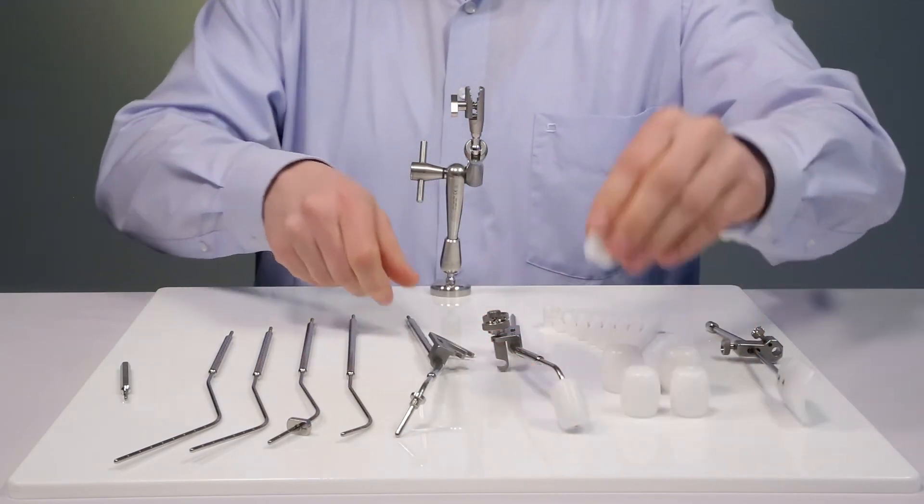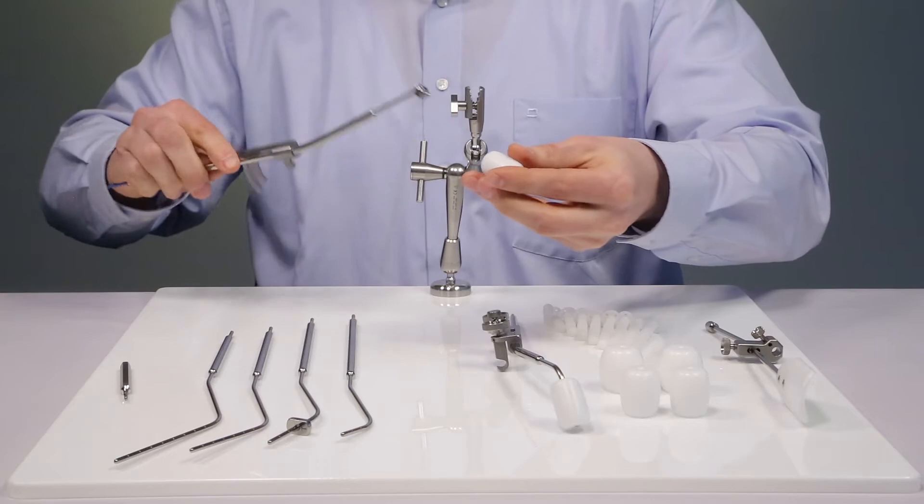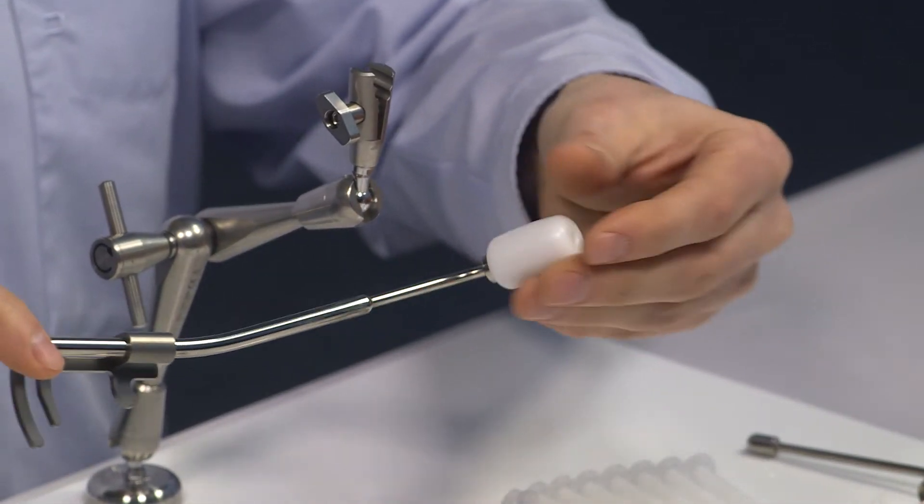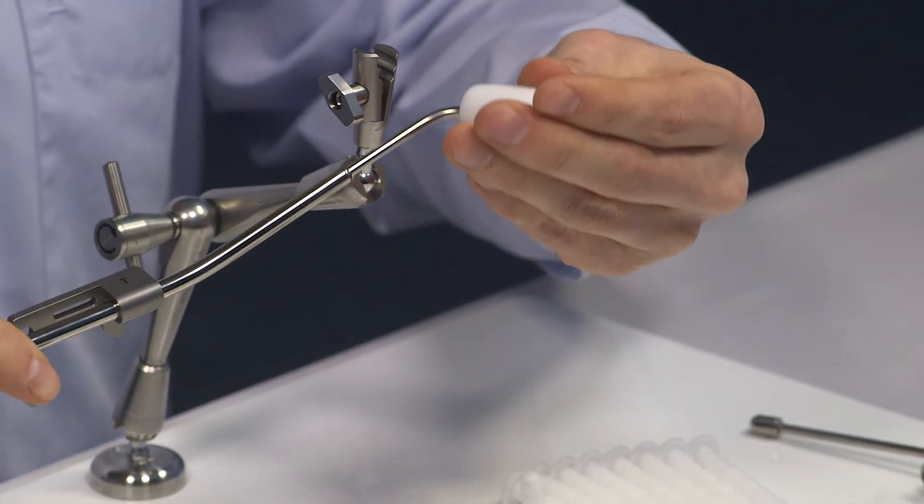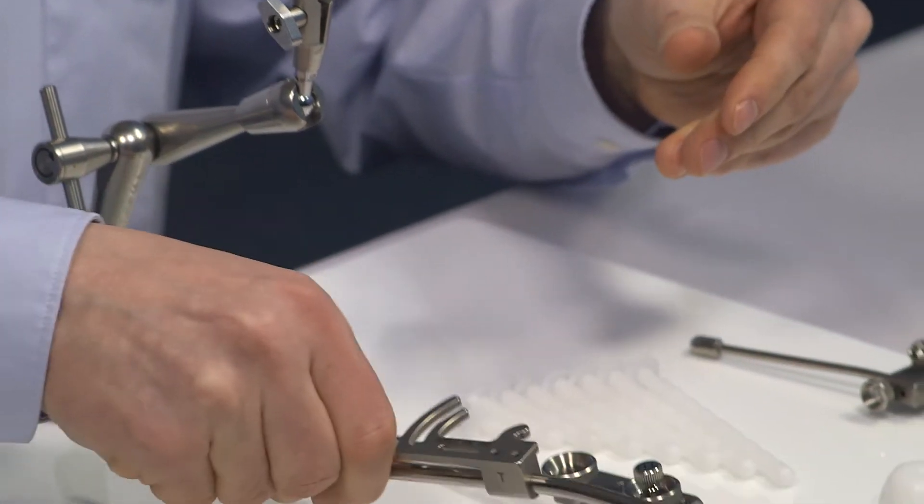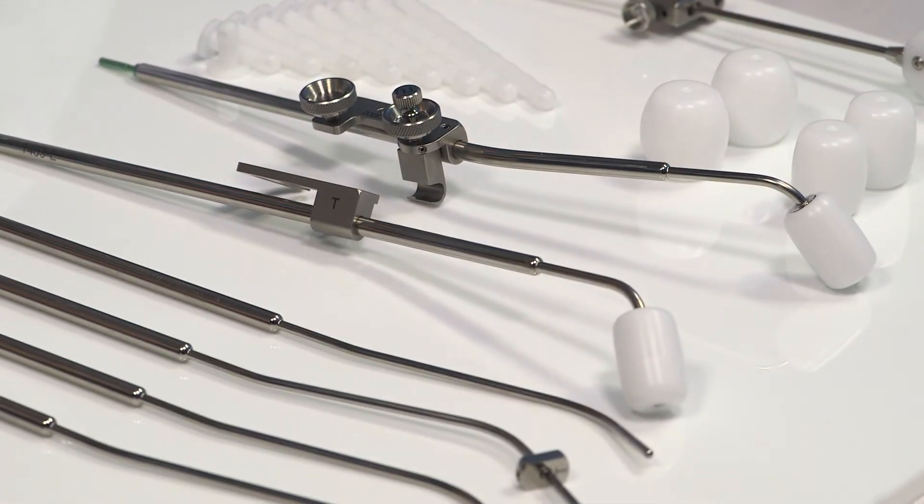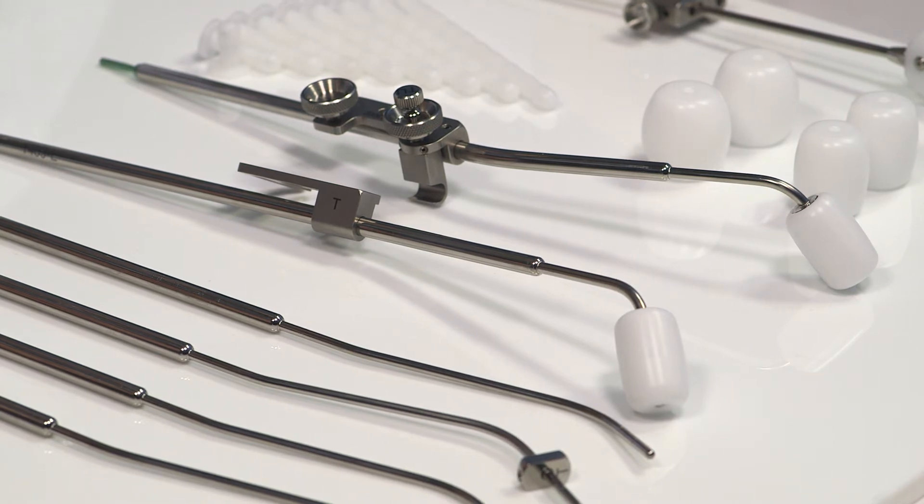Now the same for the left channel. Now the assembly is complete and we can start the insertion.